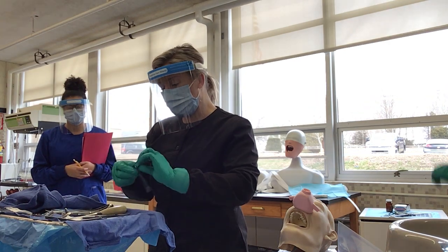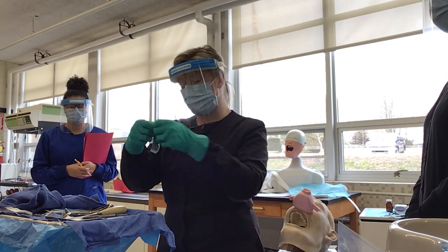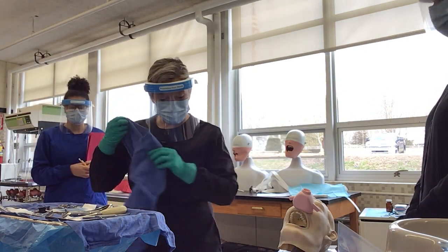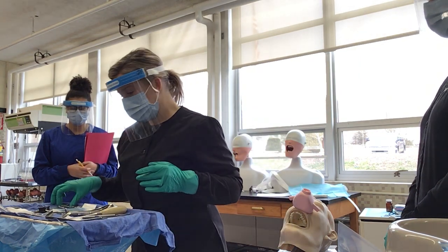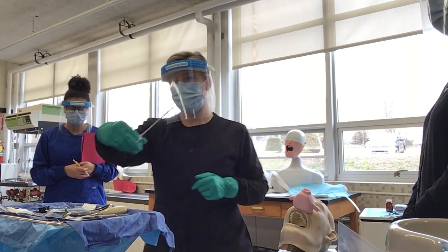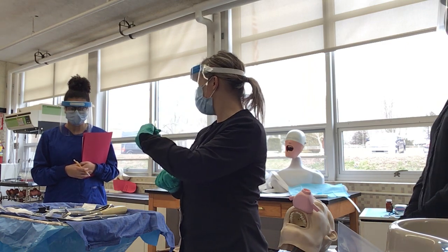Now, when you're loading it on, again, it has the end that is closed. It has the flap where it's open. I'm going to open this and that's sterile. I'm going to drop it onto my tray. I'm going to take my needle holder or hemostat and pick it up. When you pick it up, you want to make sure that you're holding it free of that window or that slot. That way we can load it on.